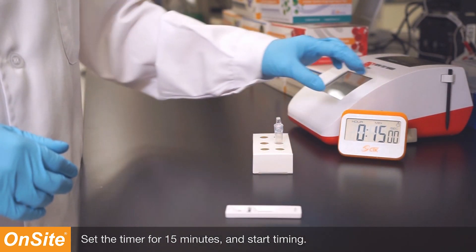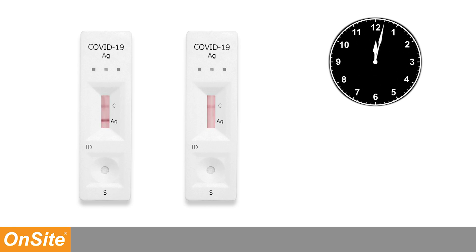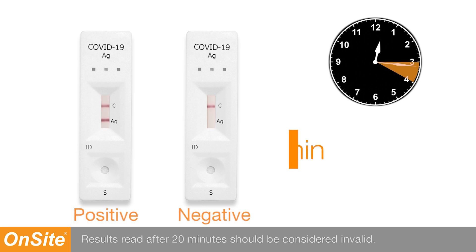Set the timer for 15 minutes and start timing. Read the results at 15 to 20 minutes. Results read after 20 minutes should be considered invalid.